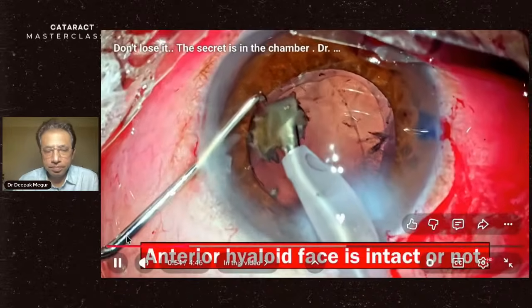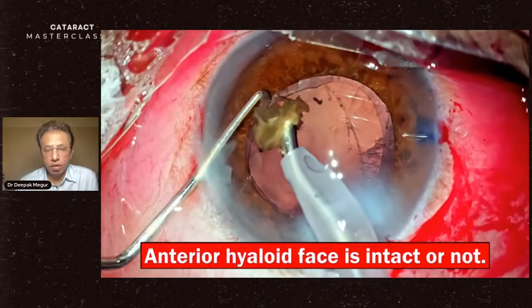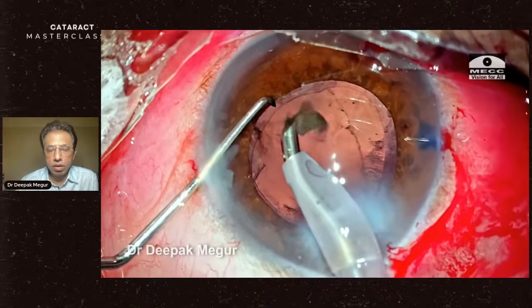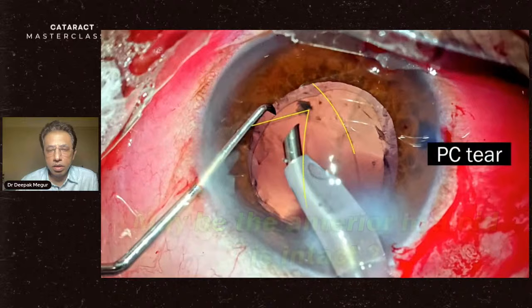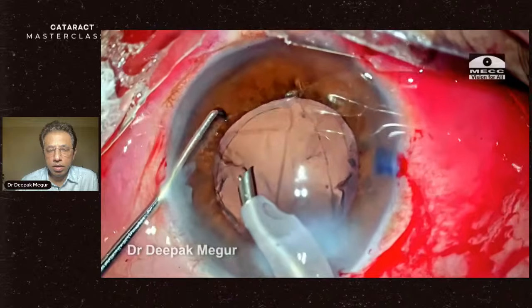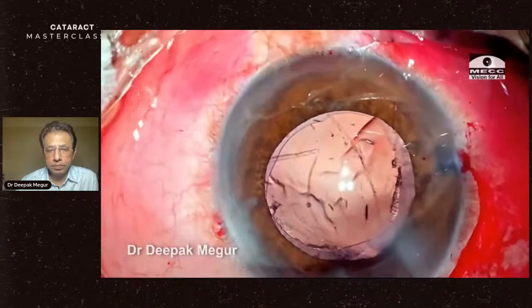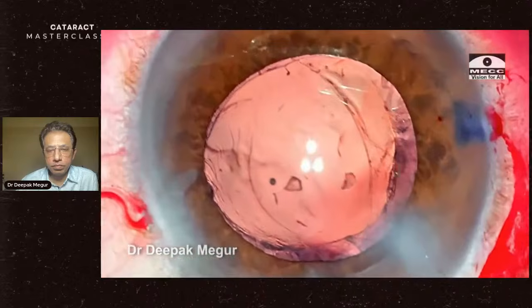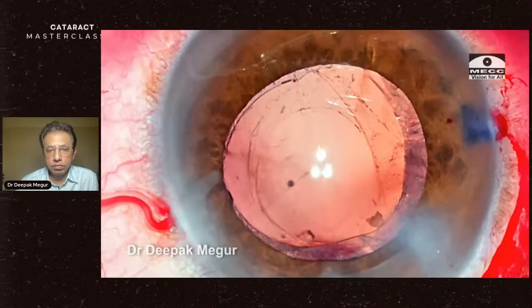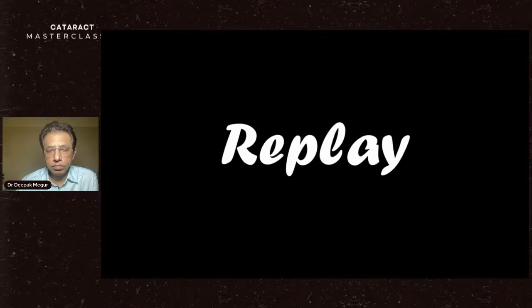At this stage, I'm not sure whether the anterior vitreous face is intact or not. Now, looking at the irregular edge of the PC tear on the left, I thought maybe the anterior hyaloid is still intact, but the real action happens now. So please don't blink. So did you see? It was like a bomb blast, except for the sound. So let me replay it.